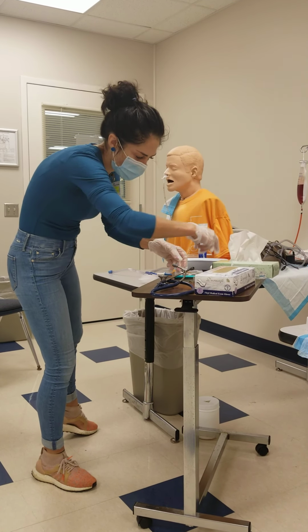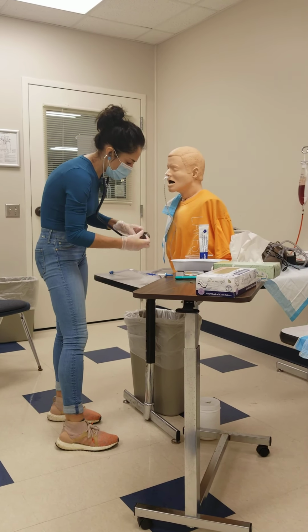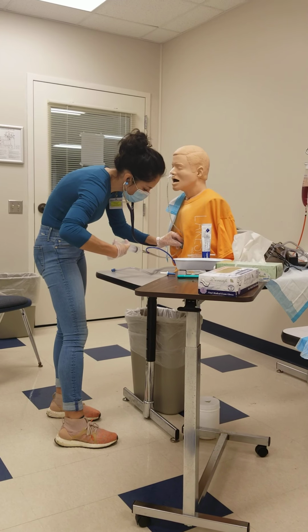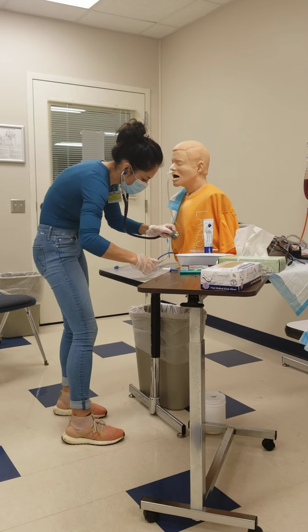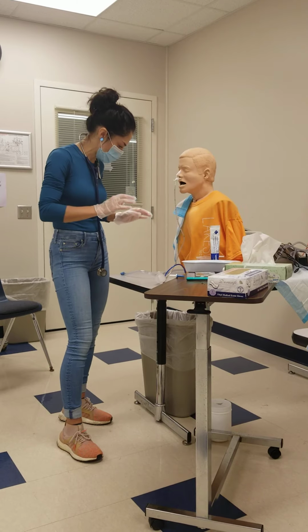Okay, put my stethoscope in, and we want to hear a whooshing or a swishing. We're going to put that right over the stomach area. Okay, yep, and I can hear it going in. So that's another way to confirm placement. And then X-ray, of course, is going to be the final way to confirm placement.